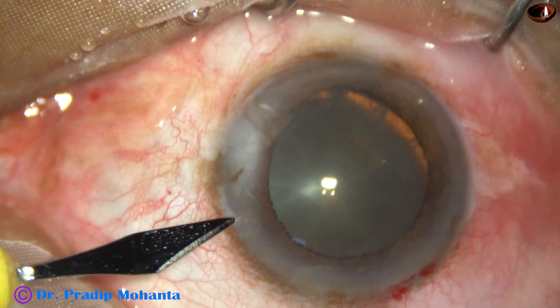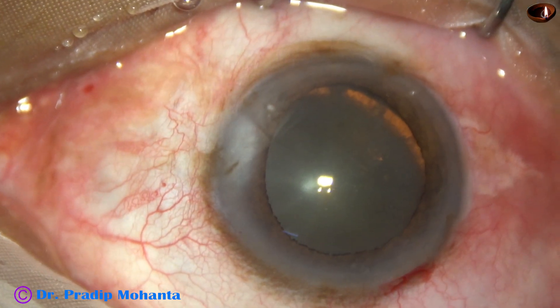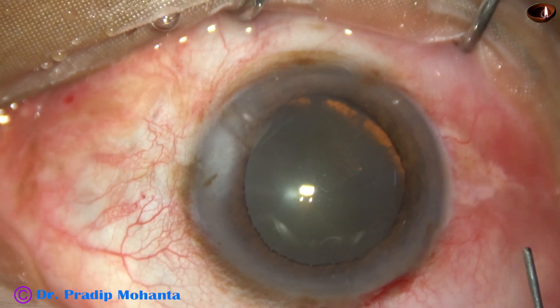Let us see the surgical steps. By this time, the main incision has been made, and there is a side port on the left side of the main incision about 3 o'clock hours away.